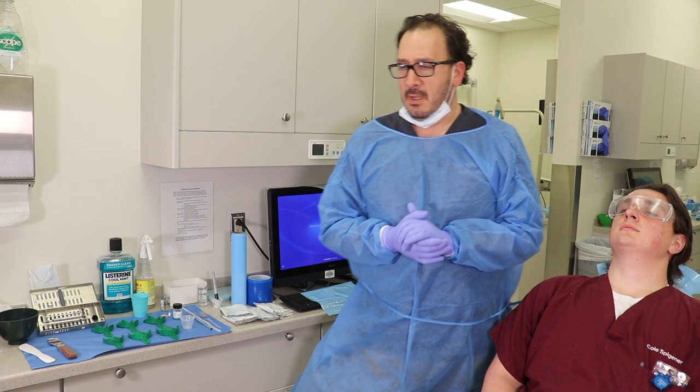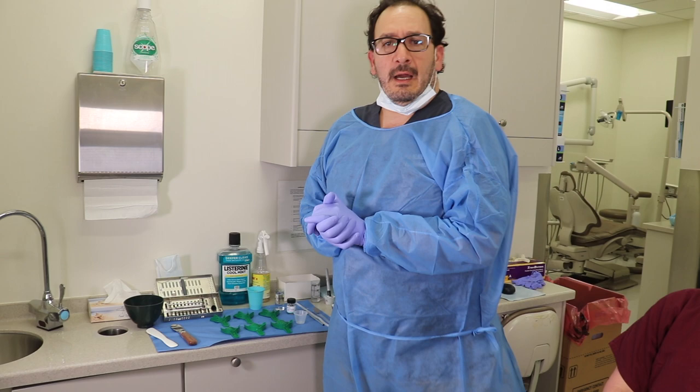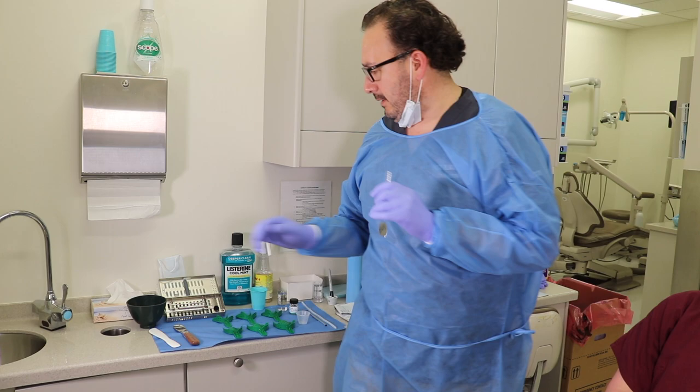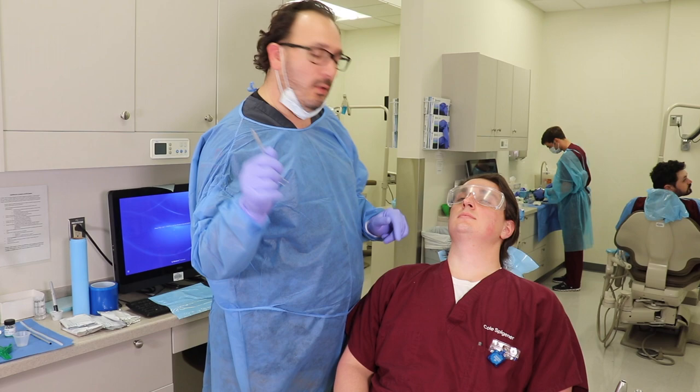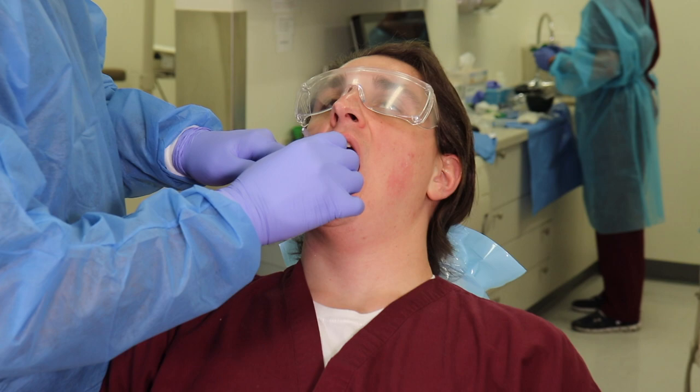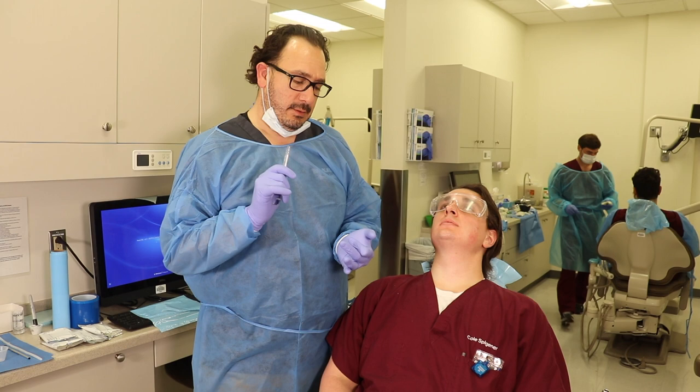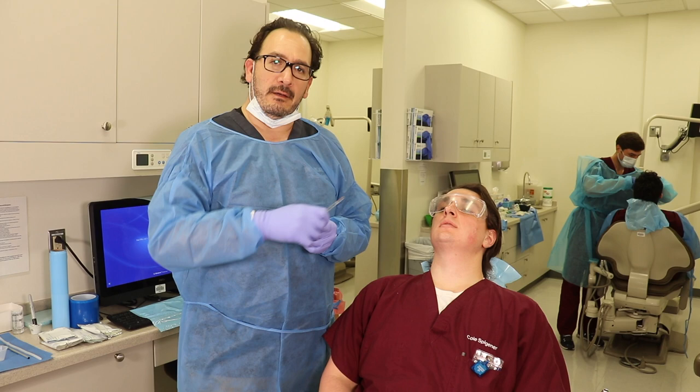The first thing we need to do is examine the patient and see what kind of tray we're going to use, and if there's anything that we need to take care of before taking an alginate impression. So we go to the patient's mouth, and what we're going to look for, open up your eyes, we're just going to do a thorough examination. What I'm trying to find is any temporary crowns, any removable partial dentures, or any other prosthetic component that might either come off with the impression or lock in the impression as I'm taking it.